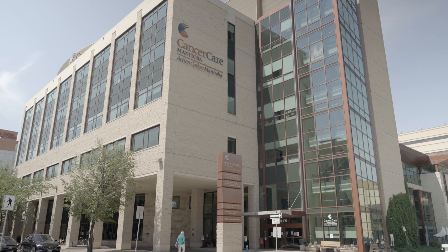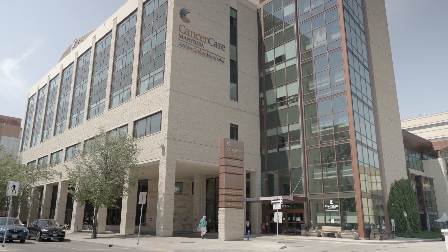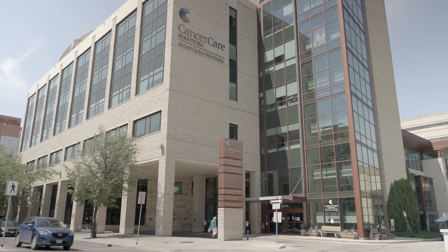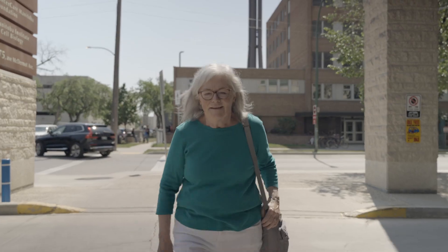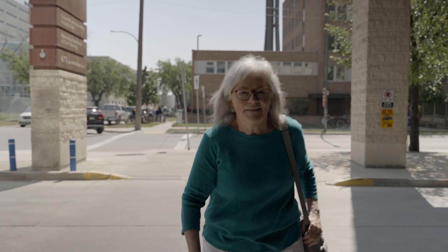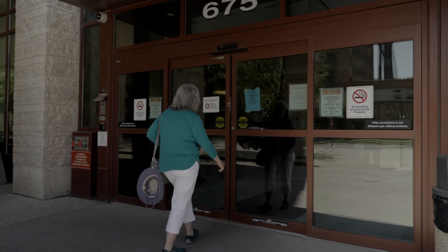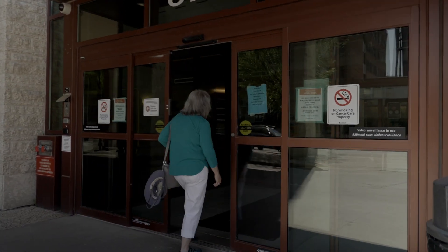Hello everyone. When preparing for your treatment sessions, you may wonder what will happen. This video will show you what a radiation treatment session on a superficial treatment unit is often like. Know that there may be differences for your treatment session from this video, as each patient receives a unique treatment plan.